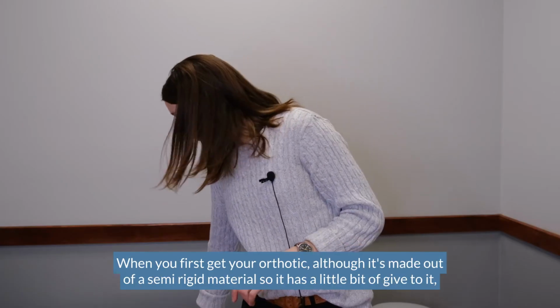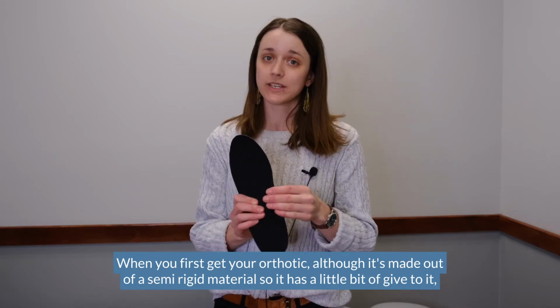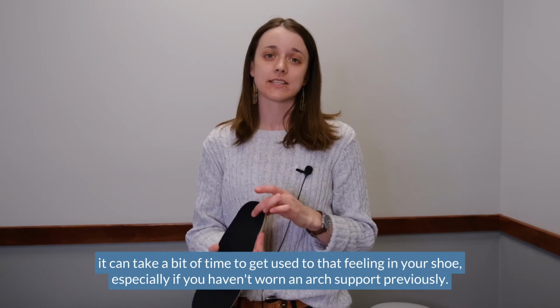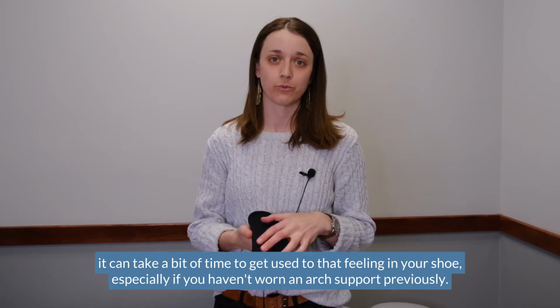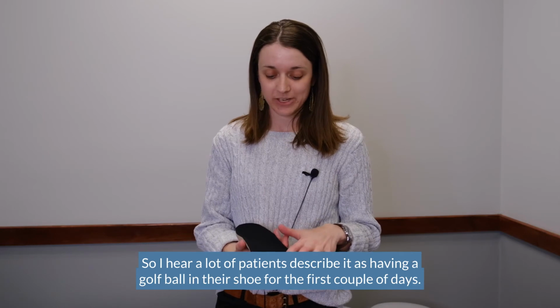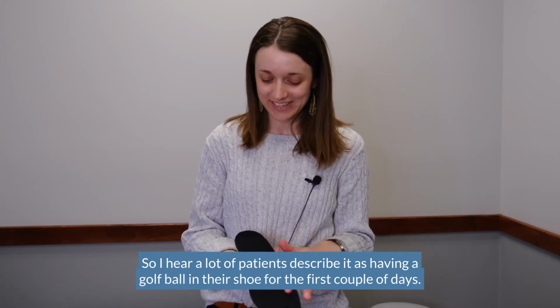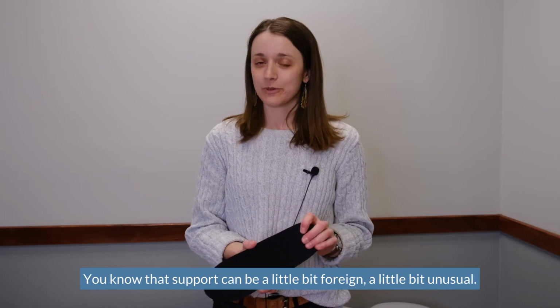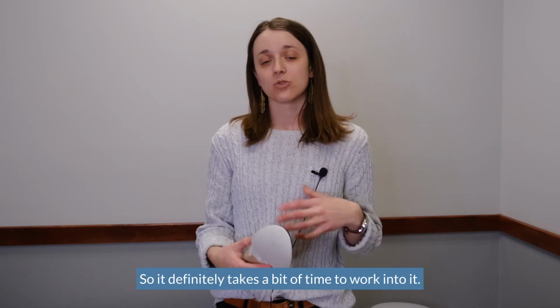When you first get your orthotic, although it's made out of a semi-rigid material, so it has a little bit of give to it, it can take a bit of time to get used to that feeling in your shoe, especially if you haven't worn an arch support previously. I hear a lot of patients describe it as having a golf ball in their shoe for the first couple of days. That support can be a little bit foreign, a little bit unusual, so it definitely takes a bit of time to work into it.